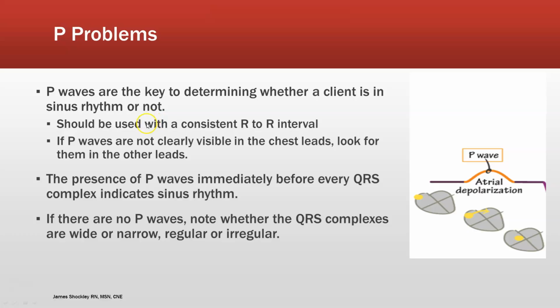It's above the ventricles. Tachycardia will give you the ranges that I'm going to use for that. It's also called PSVT, paroxysmal supraventricular tachycardia, which just means it has a sudden onset. Then we're also going to discuss AFib and aflutter.